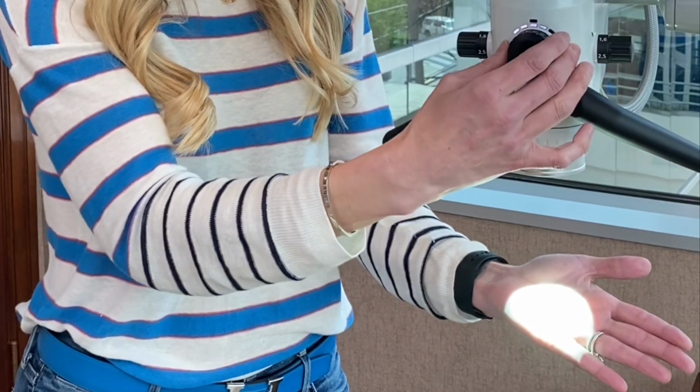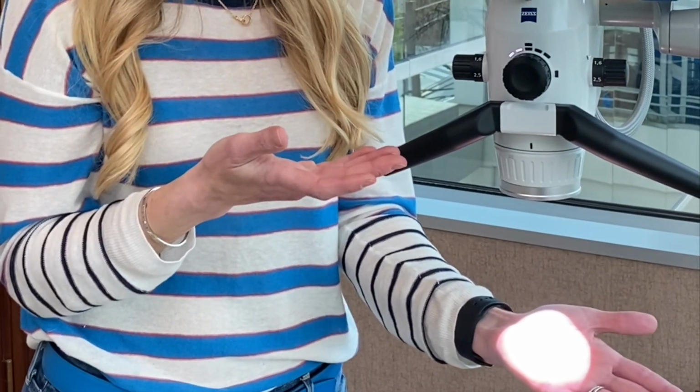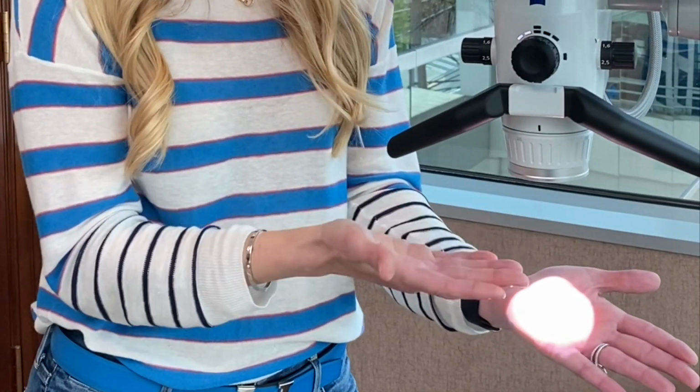this scope does have what's called true light, and what that is, it is a filter still that does help protect your procedures that are light sensitive, but you do not have the orange color that shows up. And this is really handy if you're doing composite and shade matching and you want to see what's happening to the core color of the tooth or the materials as you're placing them. It's very helpful. It's also great if you're documenting, if you're doing any photography under the scope, that you want to get images of placing the composite and placing these materials without having the dark orange filter, which can interfere with that.